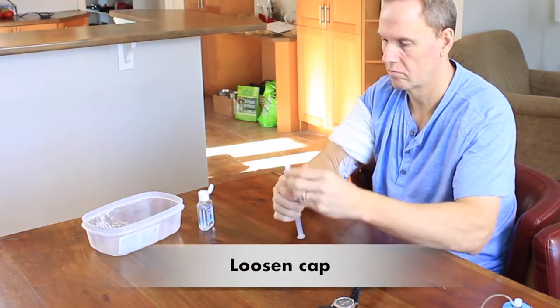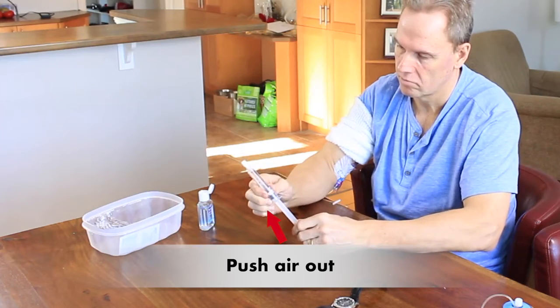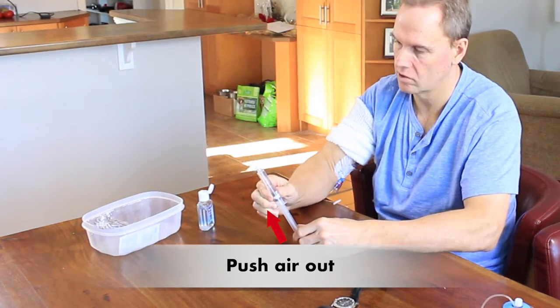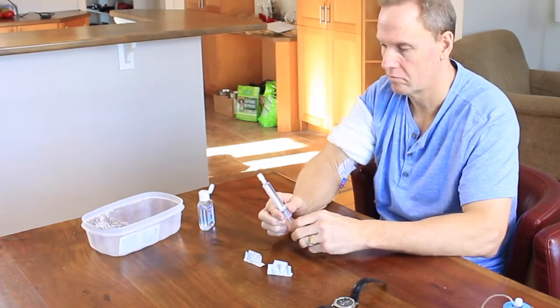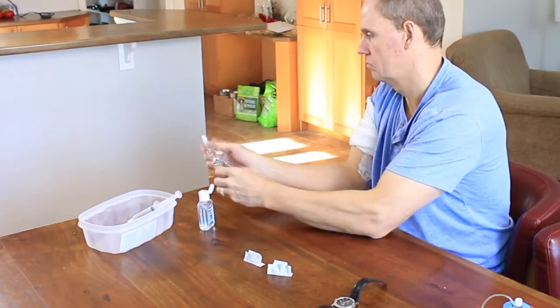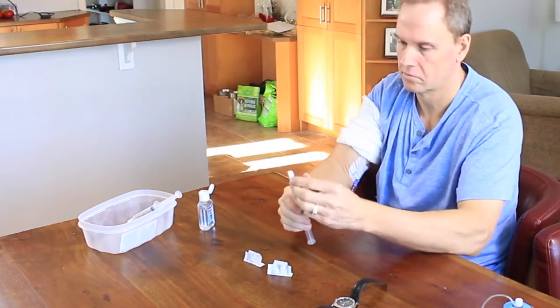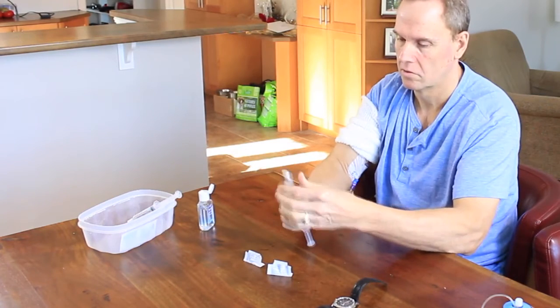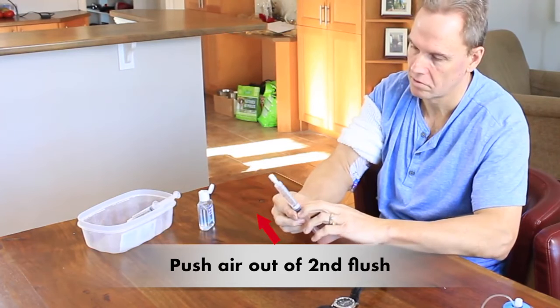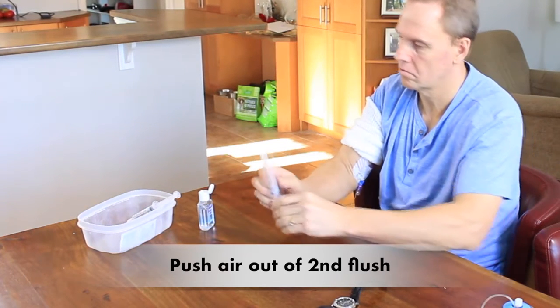You need to loosen the cap. You can pull the plunger down just a little bit, but then push it up just until you see some liquid coming out of the top. And then get your second flush ready if you were shown to use two flushes. So turn your syringe upright, loosen the cap, pull the plunger down just a tiny bit, and then push the plunger up to push any air out until you see fluid dripping at the top. Stop when you see that there's no more air bubbles in the syringe.